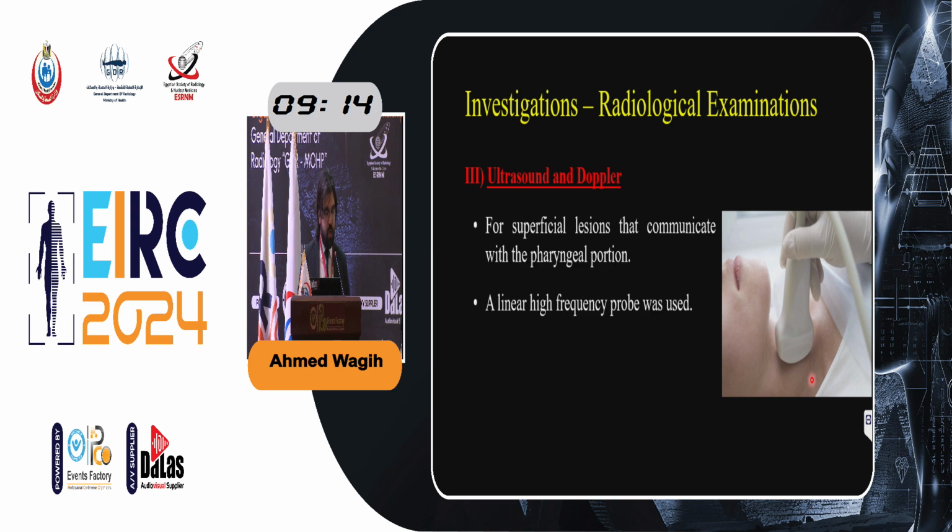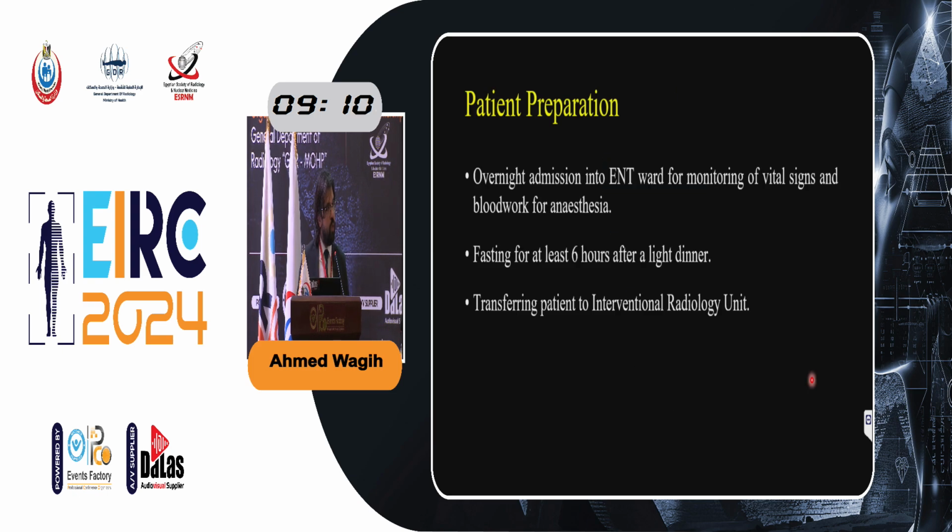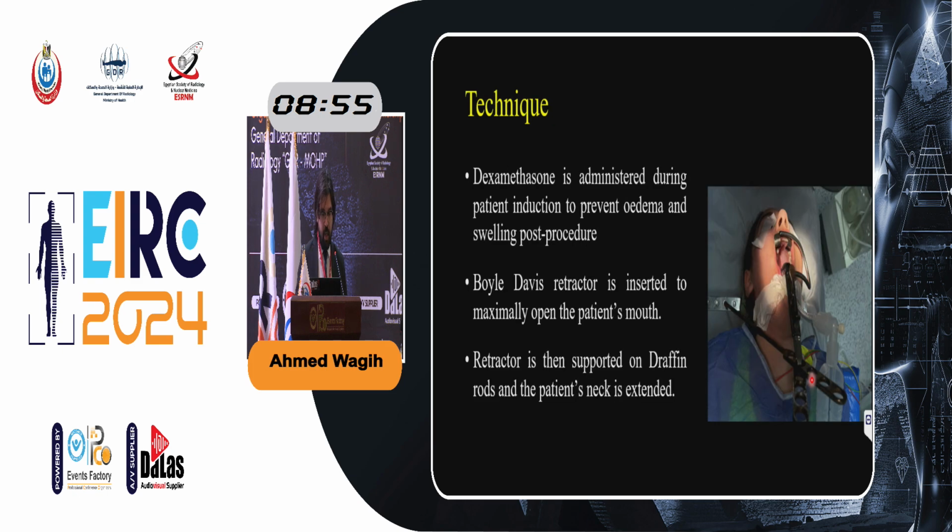And we used a linear high-frequency probe. Our technique, first of all, we do some patient preparation: overnight admission into the ENT ward for monitoring of vital signs and blood work for anesthesia, fasting for 6 hours after a light dinner, and then we transfer the patient the next day to the interventional radiology unit.